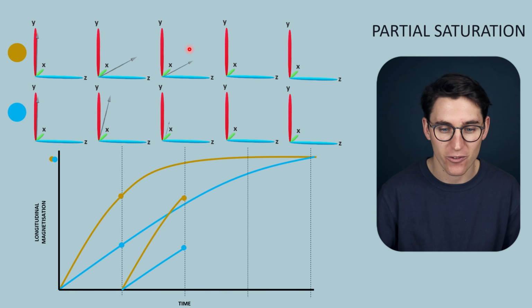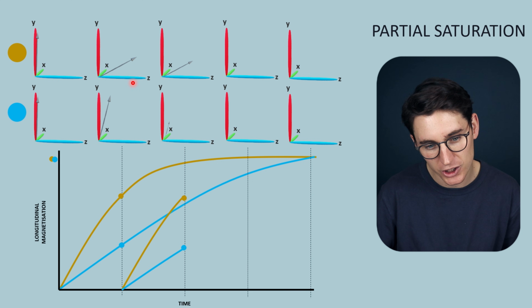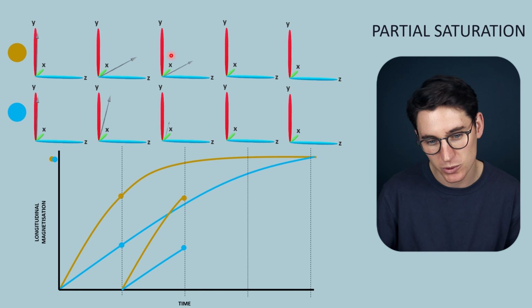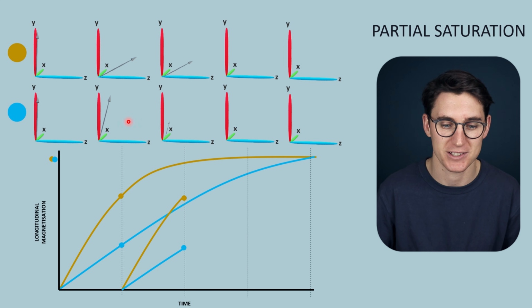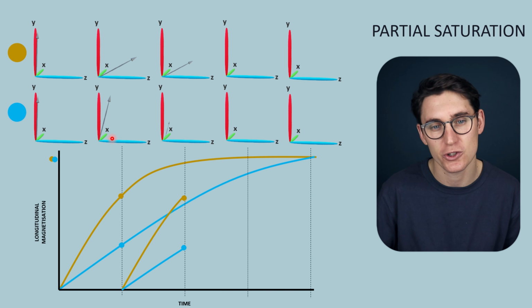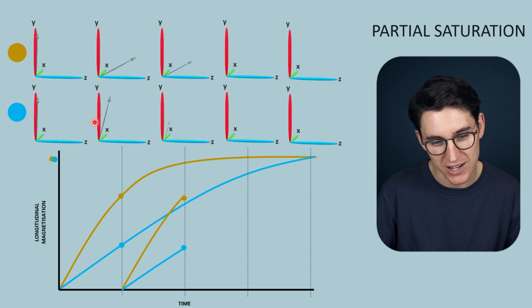Again now, our vectors are going to be different at this point. The longitudinal magnetization that we had at this point will be flipped into the transverse plane, and it will recover during this TR interval. That recovery will give us a different longitudinal magnetization vector. For CSF, we only had a very small amount of longitudinal recovery at this 90 degree flip, so we're only going to have a small transverse vector here.